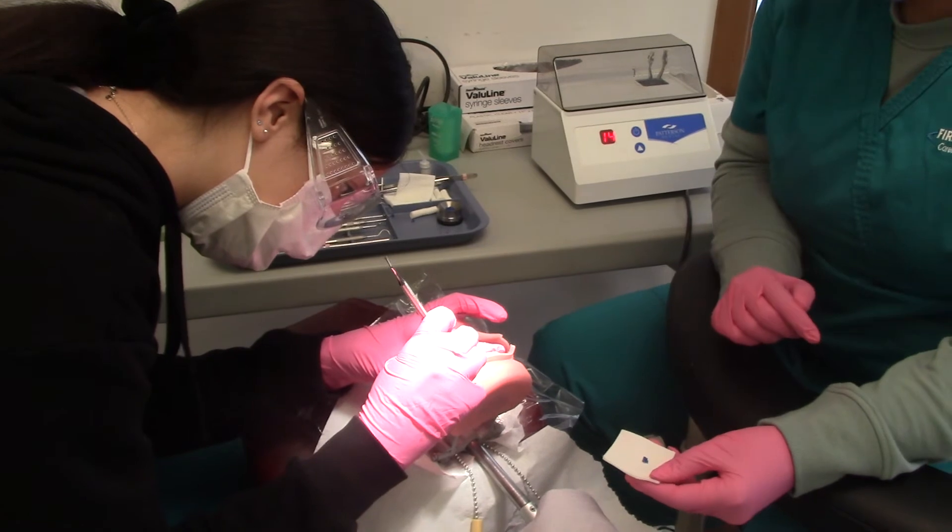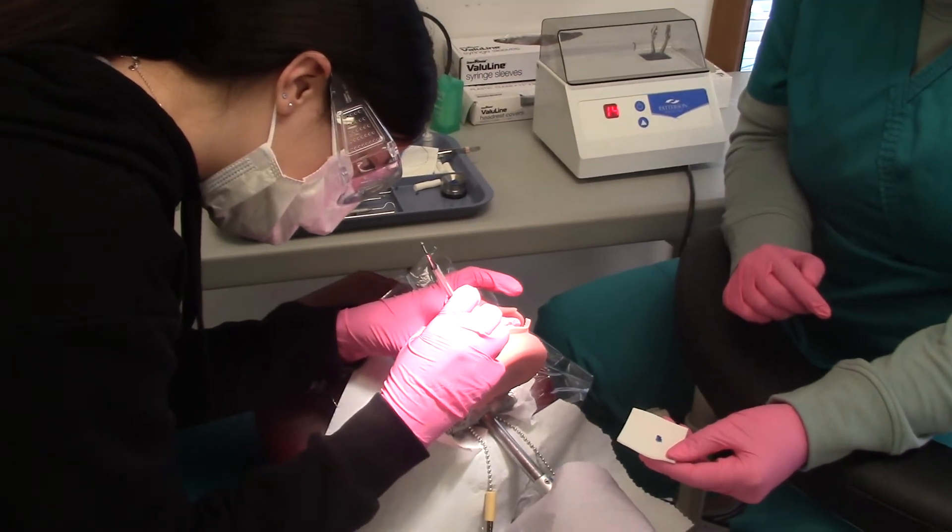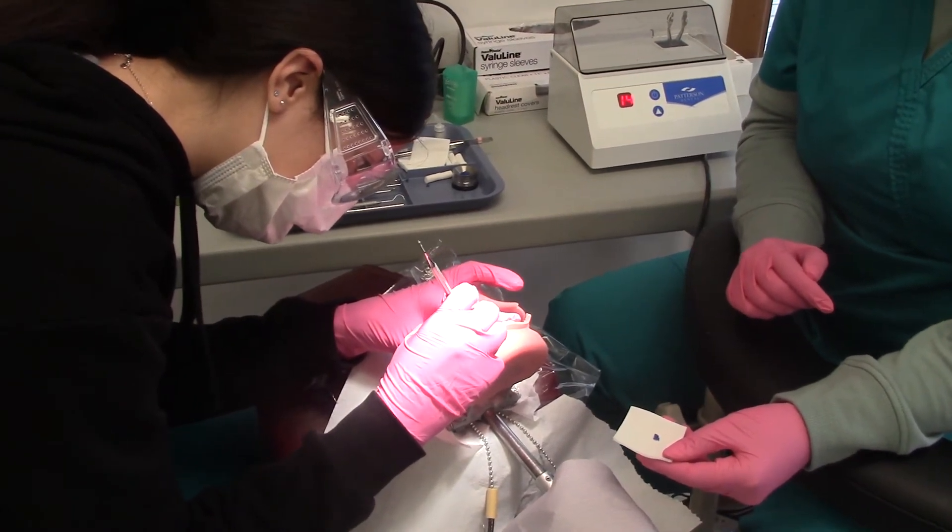We're doing top, front, back — that's what you're doing when burnishing the amalgam.